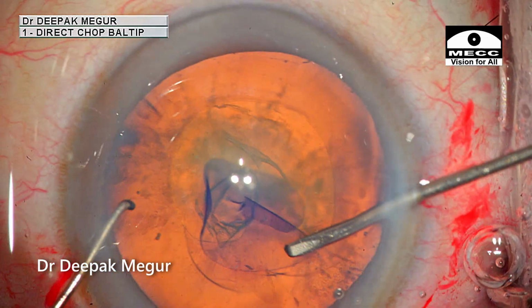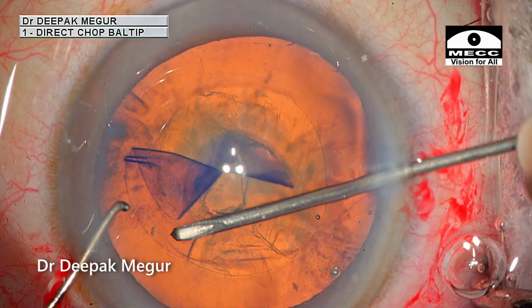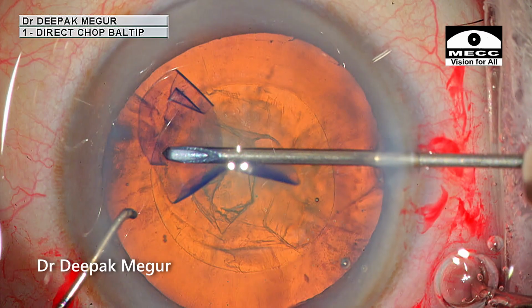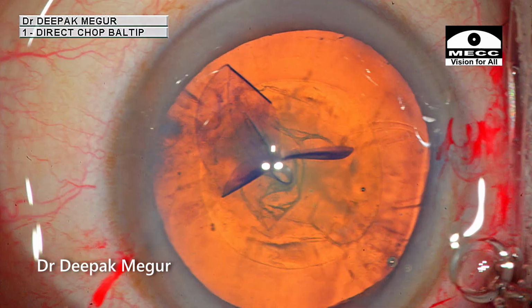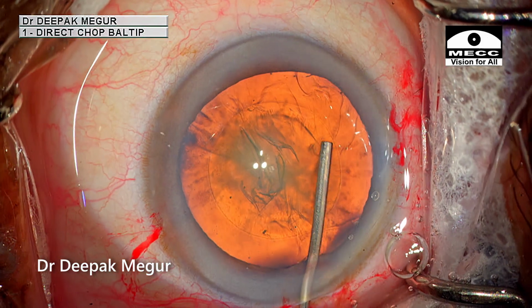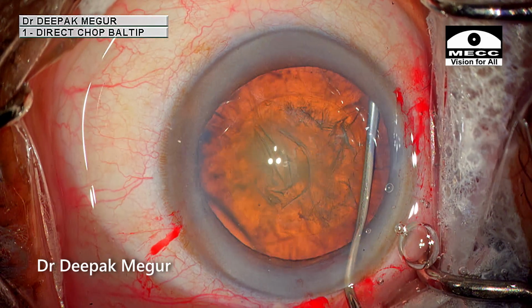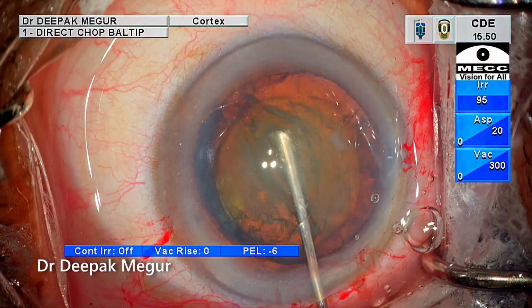So I'm aiming at around 5.5 millimeter of rhexis. It's quite challenging to size the rhexis accurately, especially when we have a very big pupil as in this case. So I'm just relying on my mental marker to assume that this is 5.5 millimeter. The capsule is lifted up and a hydrodissection is performed, and I just tap the opposite quadrant to let out the fluid. I'm just trying to do a hydrodelineation, trying to ensure that I'm able to see some amount of golden ring there. Yeah, it is there, but the endonucleus also is quite big in this case.